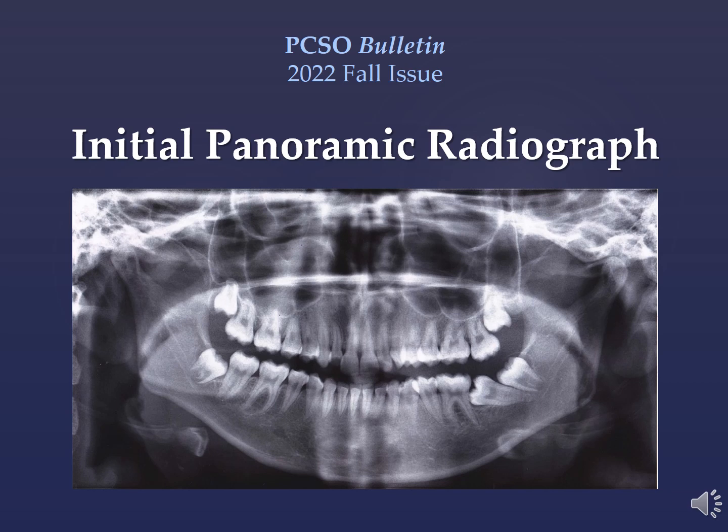The initial panoramic radiograph shows an almost horizontally impacted lower left permanent mandibular second molar and a mesioangular impacted third molar. Mandibular third molars had two-thirds of the root development finished. No other significant findings were present.